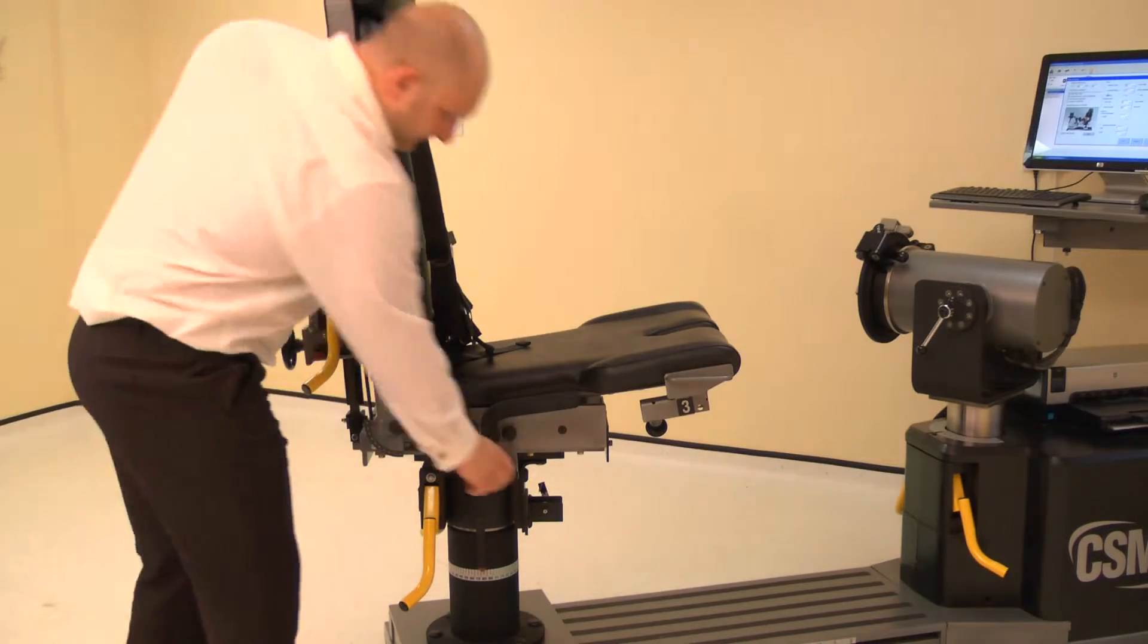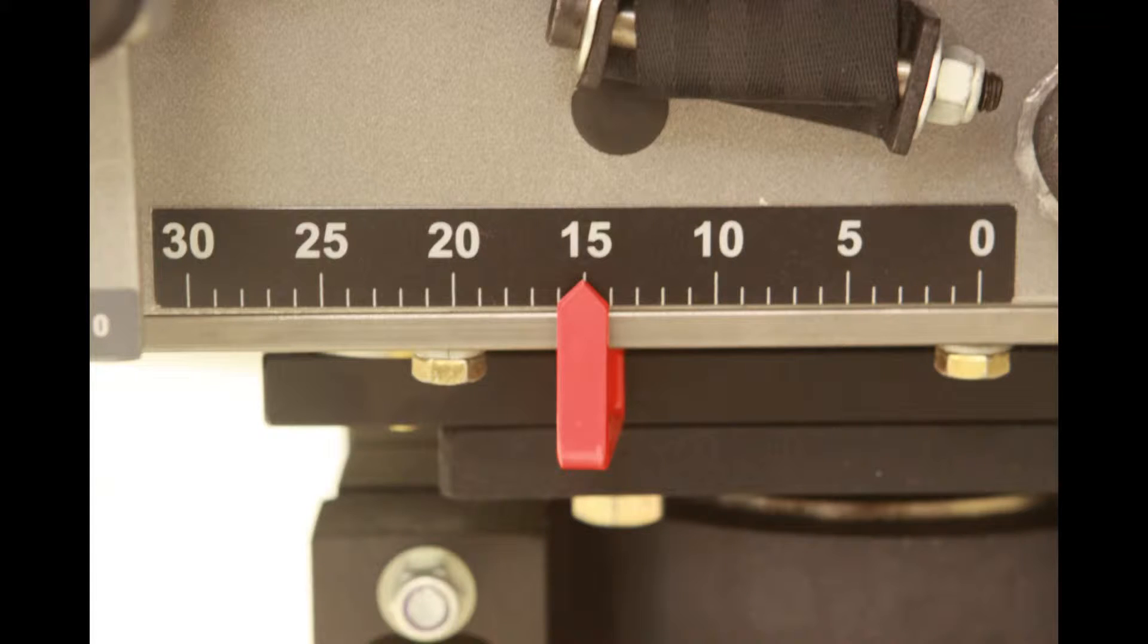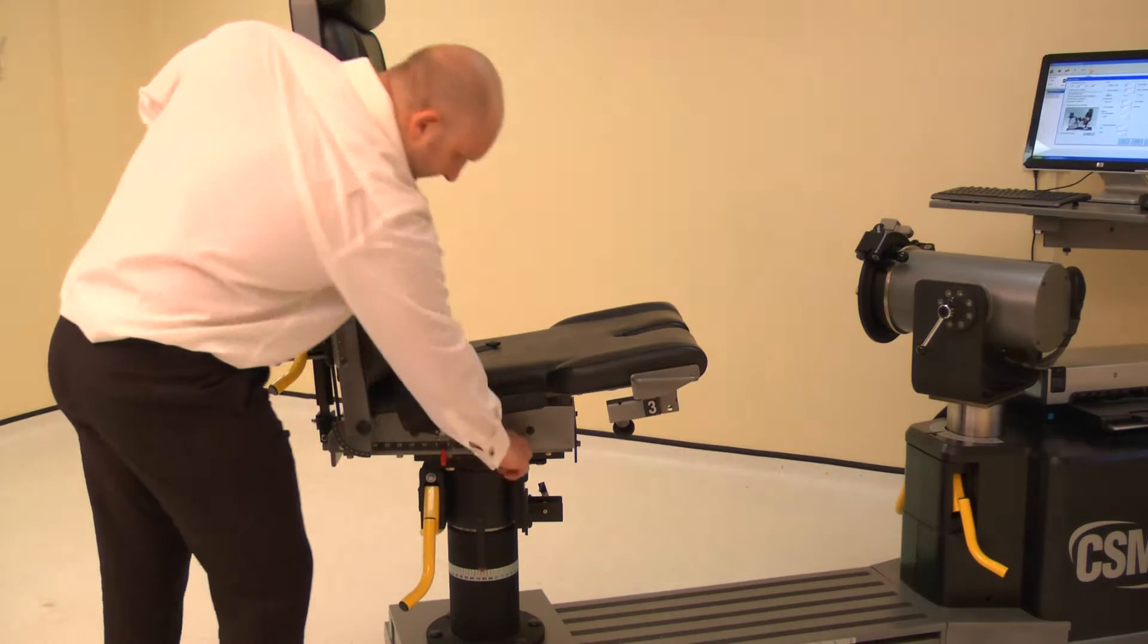The chair fore aft is altered by raising either locking handle, then slide the chair bottom forwards or backwards. Adjust the chair fore aft to position 15. Lower the locking handle to secure.